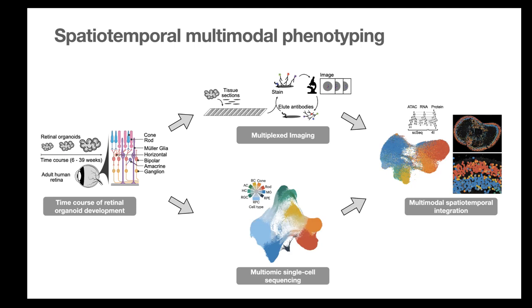antibodies on FFPE. Right? And my main task here was then to bring such data sets, which have a temporal component and this multimodal component, but from different experiments, together in one representation. So working on digital multi-omic representations of organoids. That's the whole aim here, reaching this endpoint of multimodal spatiotemporal integration.